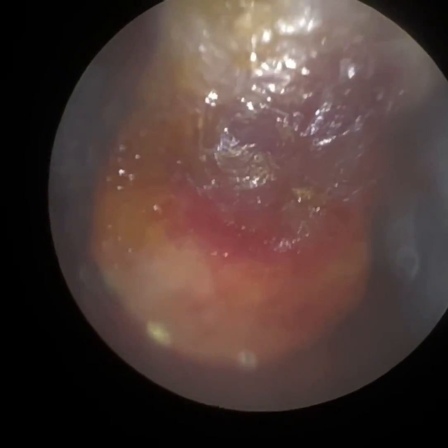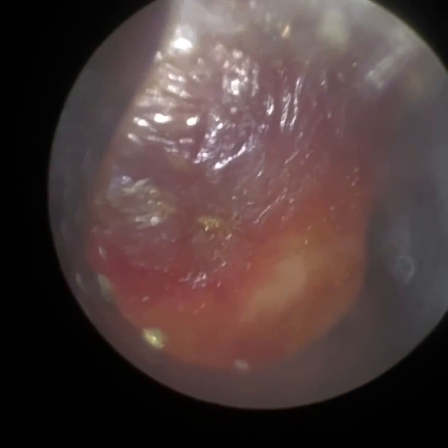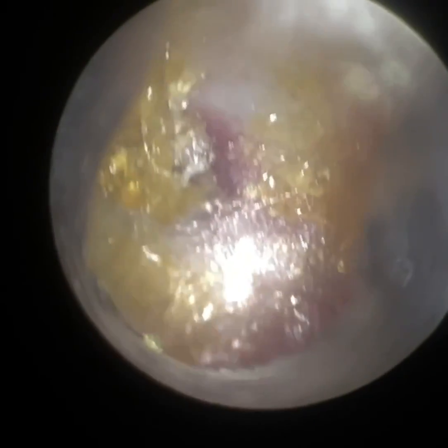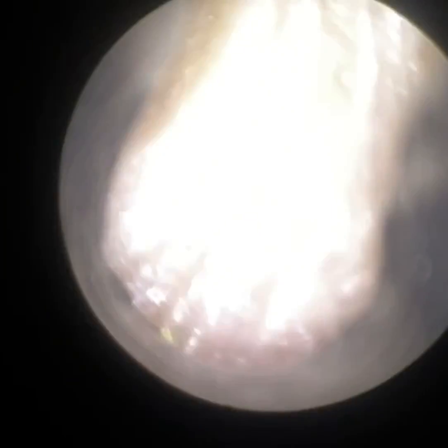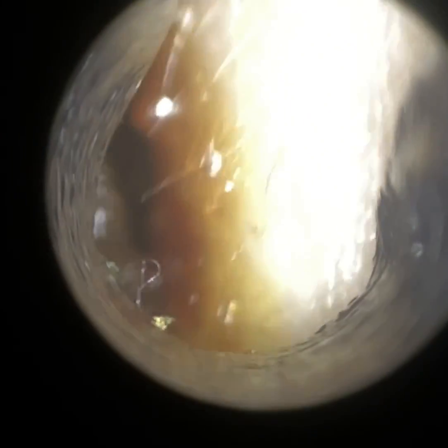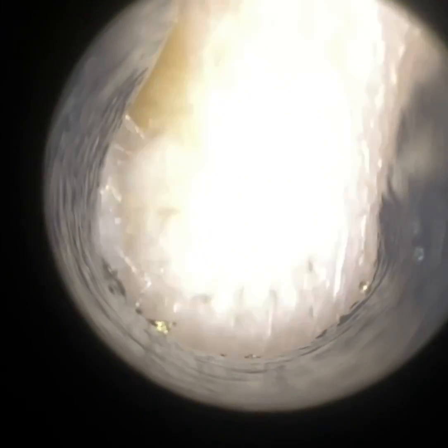There's a lot of fluid behind this patient's left eardrum in their middle ear cavity. We've referred them to their GP, and they will probably need an ENT referral as well, because you can see just how bulged it is. The patient has been suffering from chronic nasal congestion, which can block the eustachian tube, creating a vacuum effect in the middle ear cavity. Any remaining air in the middle ear gets absorbed by the neighbouring cells, which then causes fluid to seep out of those cells into the middle ear. And because the eustachian tube is blocked, it can't drain and then it builds up.